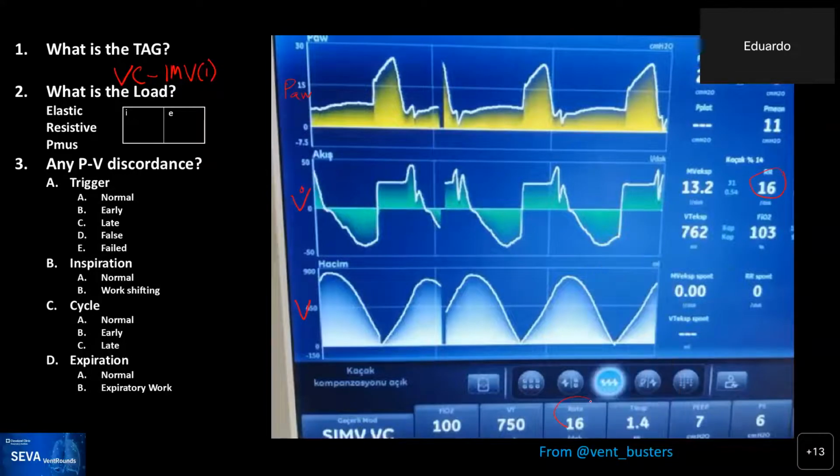And that can happen with SIMV. If you set the rate too high, you will not be able to see spontaneous breaths that may occur. And then this is called set point because both the flow was set, the tidal volume was set, and so all the characteristics of the breaths, both the spontaneous and the mandatory breaths, are both set by you guys.